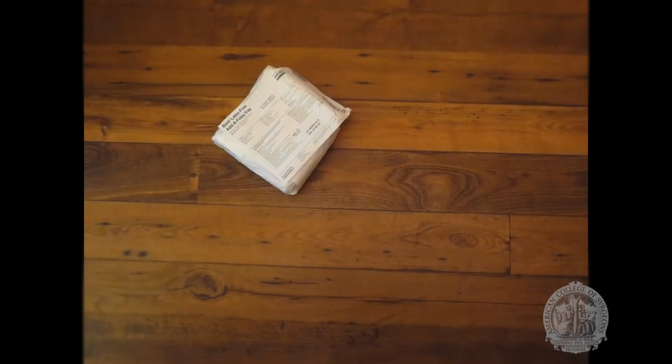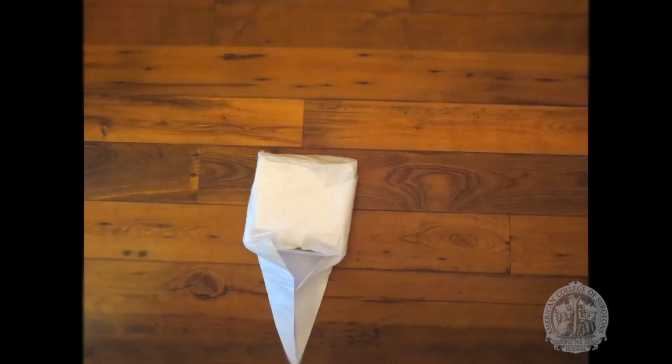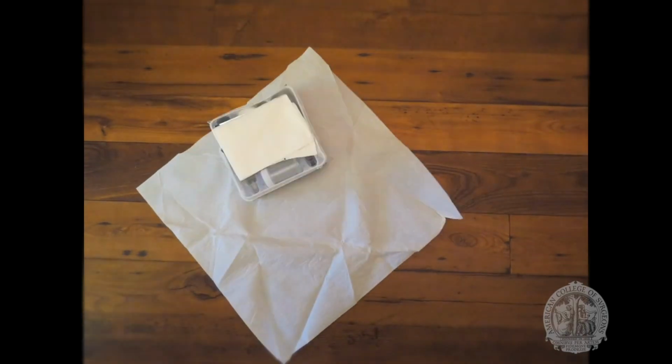Most institutions use commercially available catheter insertion kits that contain all the necessary items you'll need for catheter insertion. In that case, all you'll need to do is look on the outside of the box and choose the appropriate size catheter for your patient. 16 or 18 French is typical in an adult. Let's look at a kit that contains everything you'll need.